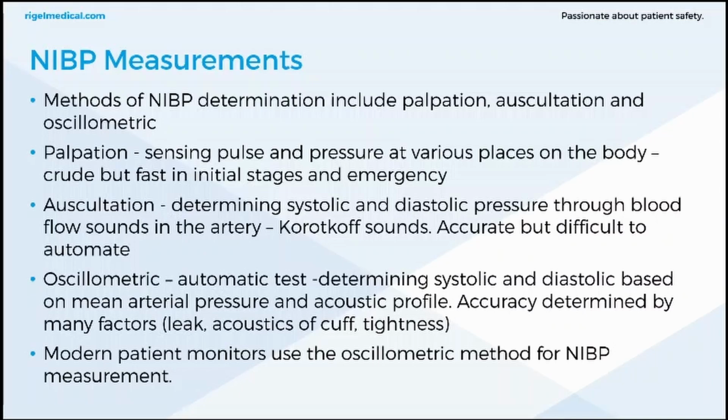There are 3 different methods. Primarily, we are only interested in the oscillometric method, which is the one that patient monitors use, and patient simulation. You've also got palpation. This senses pulse and pressure at various places in the body. It's crude but fast in initial stages and emergency. There's auscultation, determining systolic and diastolic pressures through blood sounds in the artery, Korotkoff sounds, accurate but difficult to automate. So these are required to be performed by clinicians that understand the Korotkoff sounds, you know what to listen out for in the artery.